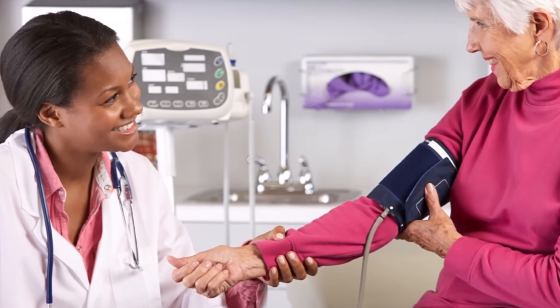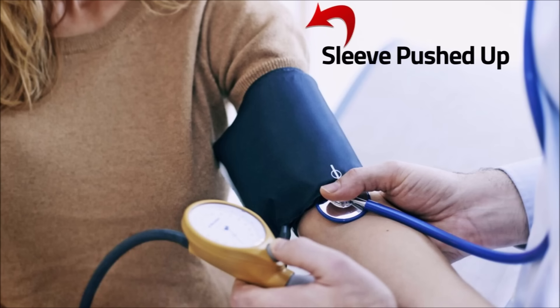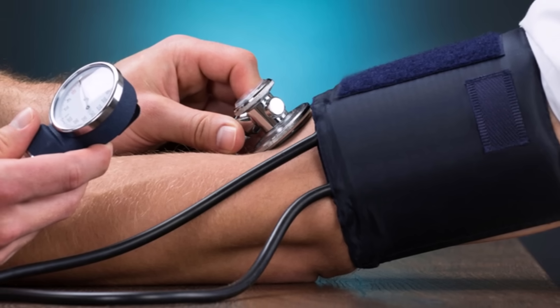Another thing with the cuff is not wrapping it around clothing. No matter how thin your sleeve may be, the cuff should be wrapped around your bare naked skin.